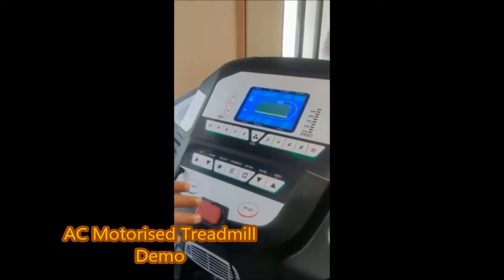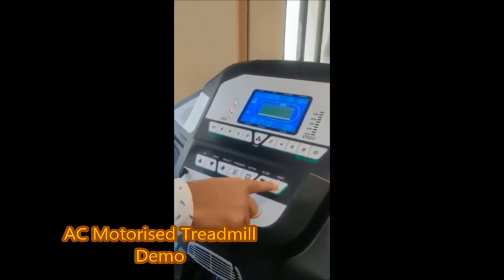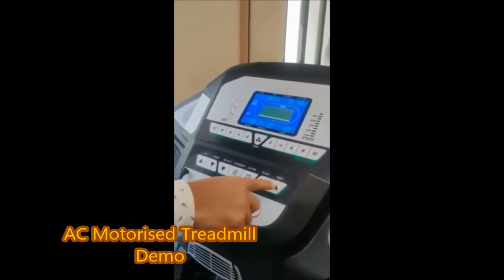You have to give the speed from here. If you want to increase the speed, you can increase the speed from here. This will be done manually.